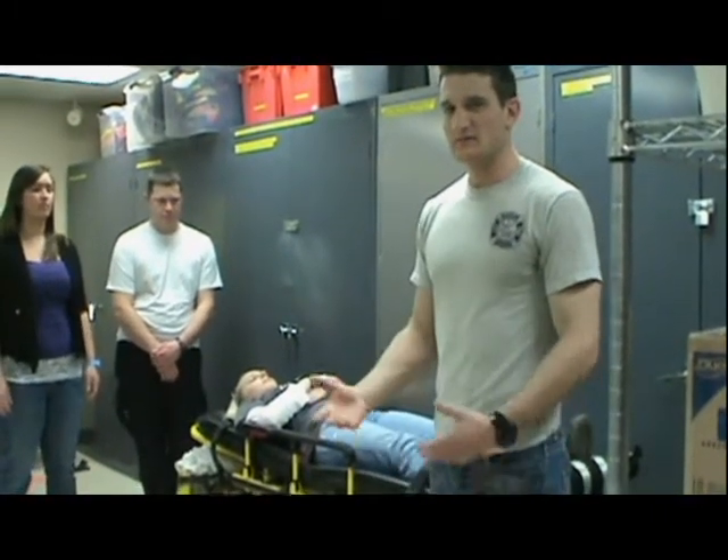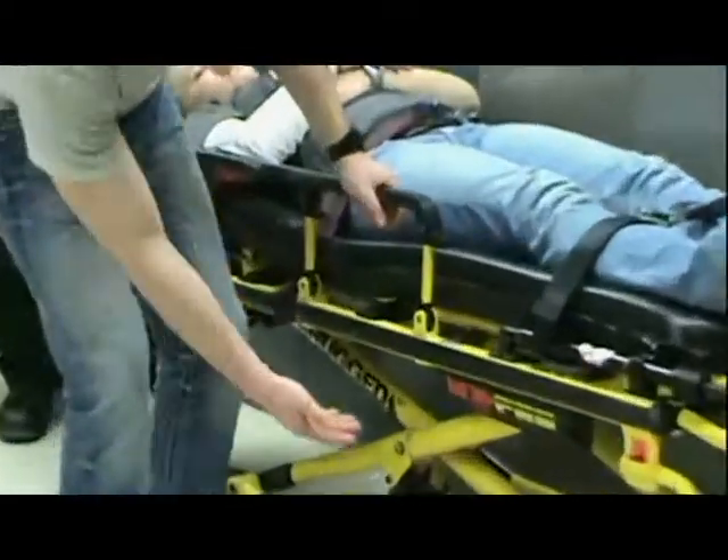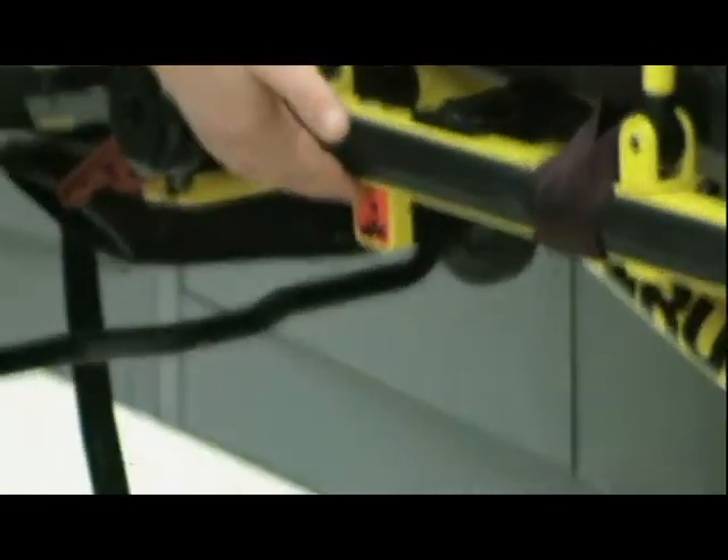It's imaginary, but for the side people, there are points on here that you have to watch for with your hands. Right here it says possible pinch point, so be aware of that.